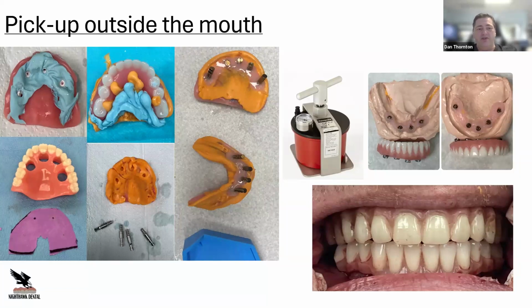With that, you can do two different techniques on this pickup. One is you can use that denture, drill the holes, and then use old closed tray transfers to pick it up underneath the denture like a wash. Then you can go back to the little lab for the day and pour up a model so you can do your conversion outside the mouth.